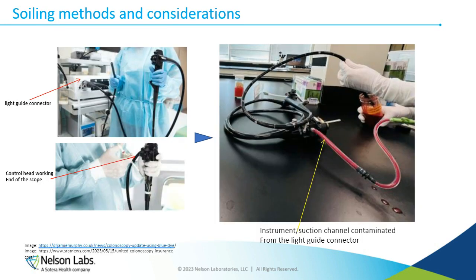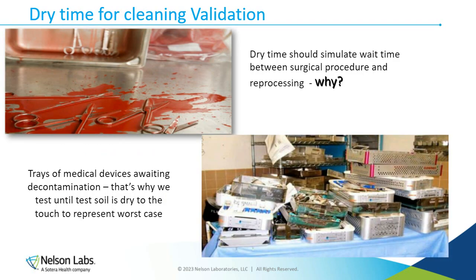And soiling methods for flexible endoscopes, right? If you see the light guide is connected to the computer, but if there's a backwash, or there's ever a problem, this portion might get contaminated. And so that does get simulated in actual laboratory testing as well.